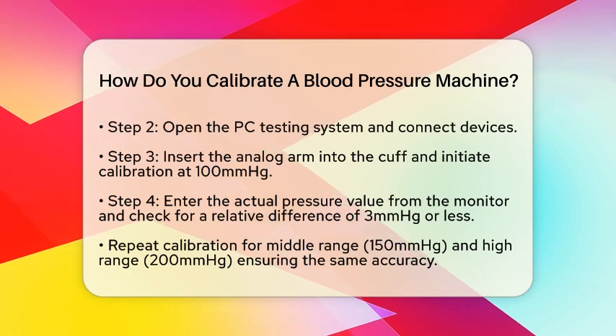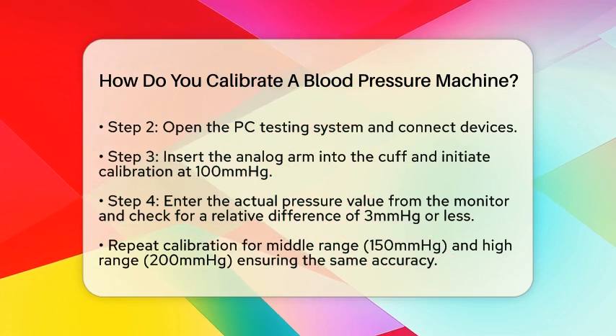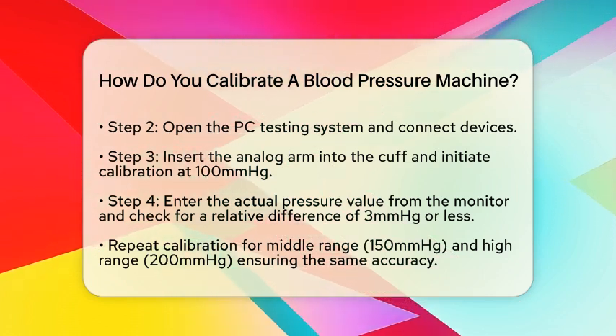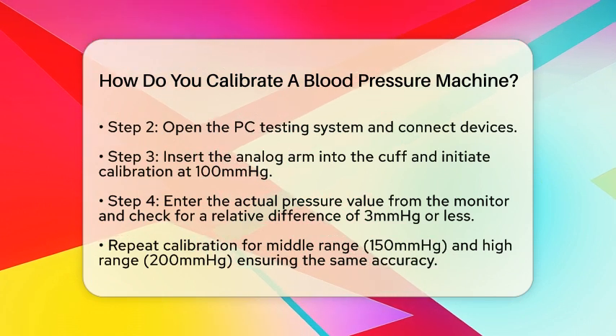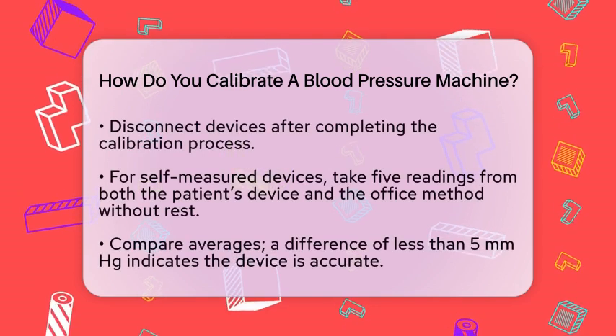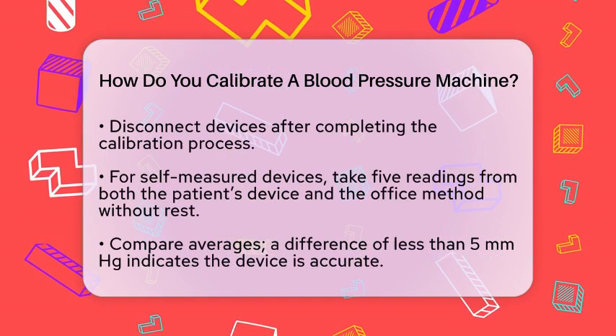Repeat this process for the middle and high range calibrations. For the middle range, click Approval 150 mmHg and follow the same steps. For the high range, click Approval 200 mmHg and do the same. Each time, ensure the relative difference is less than or equal to 3 mmHg.